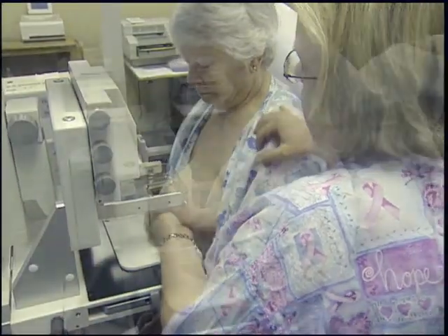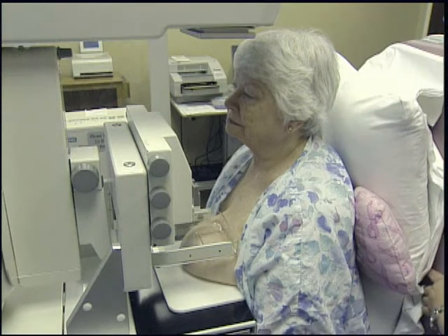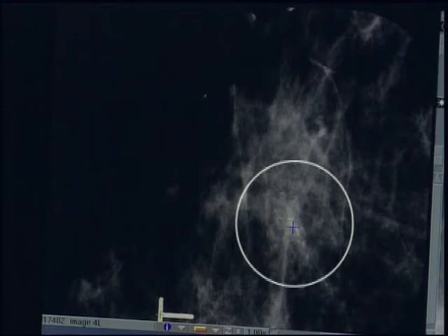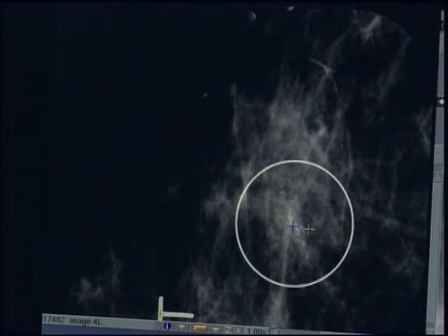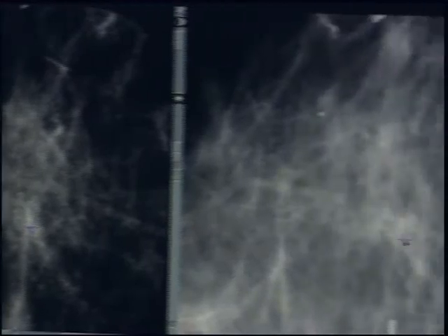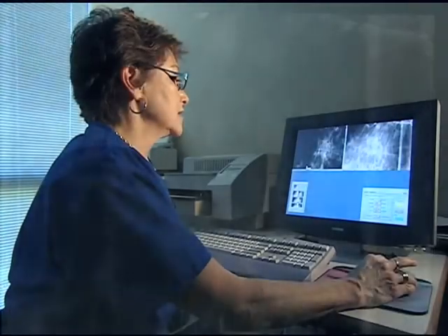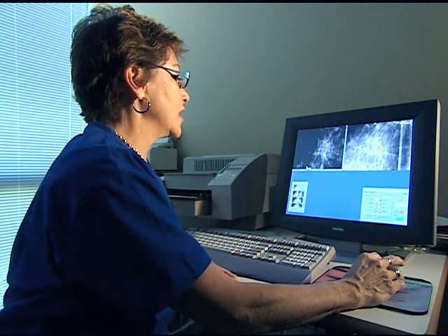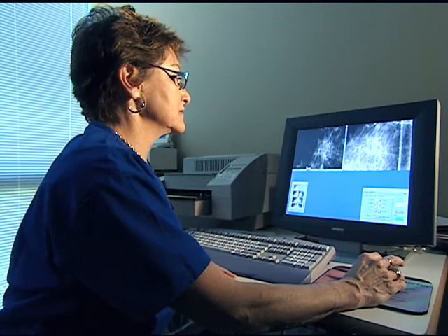The patient is positioned to acquire the initial stereo pair scout images. We have just taken the stereo pair and I have placed the markers. I choose a place where the calcifications are relatively dense and representative of the abnormality. We place one mark here and then on the opposite stereo pair we place the other mark, and clicking on these alerts the computer to put the x, y, and z coordinates into the system, which are then transmitted to the unit.